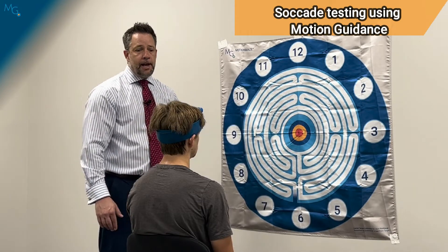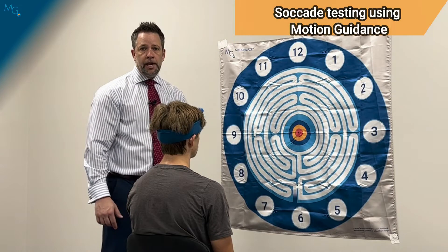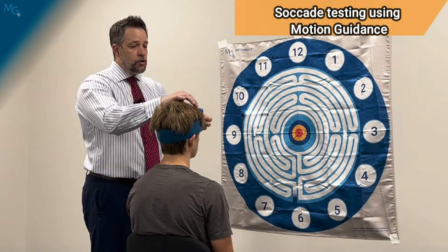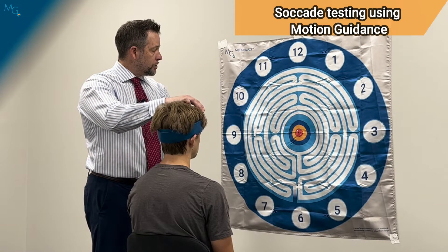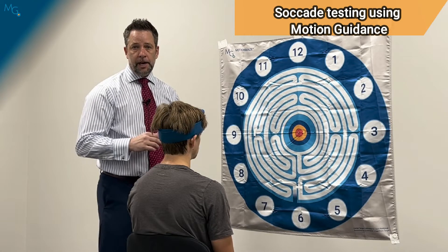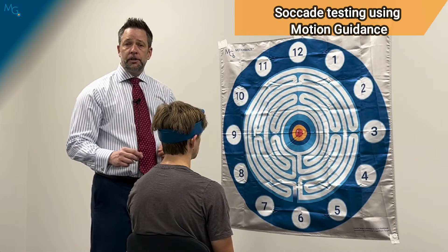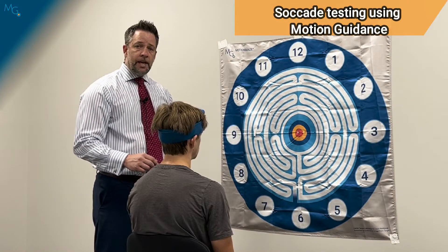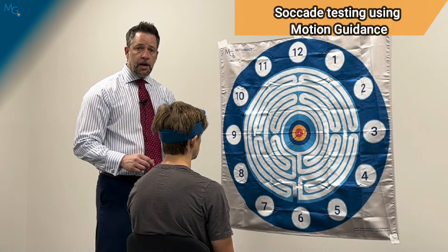To standardize this test, we are going to have the patient look directly at the bullseye in an upright posture. Then I can hold onto the perpendicular mount, turn on the laser, and use the ball and socket joint to put the laser into the red field of the bullseye. This helps me understand if the patient is starting to change posture during the test, or if the laser is moving, that will tell me what is happening as they go through the application of saccade.